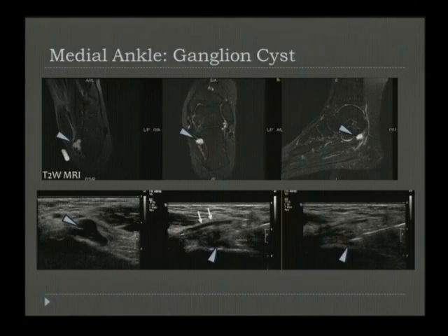The patient was having symptoms referred to this. The surgeon was wary of going in there and removing this. Typically, they will go in and find the neck of these ganglion cysts and remove the entire thing. He was concerned because of the proximity to the nerve as well as to the vasculature, and so he asked if we would try to aspirate this particular ganglion cyst.